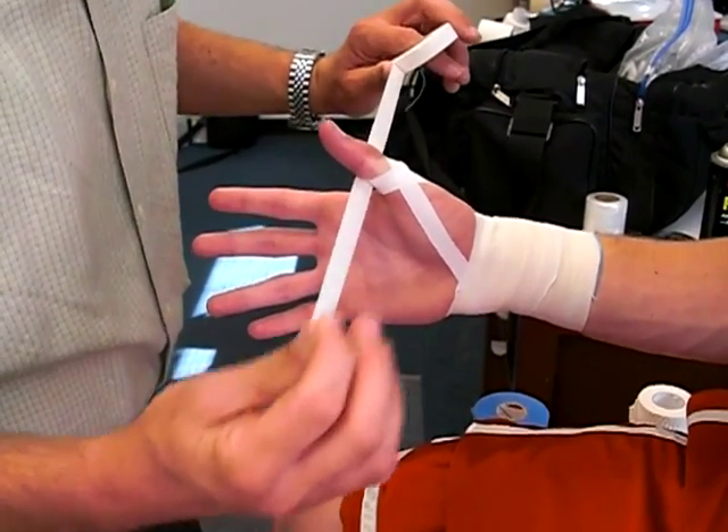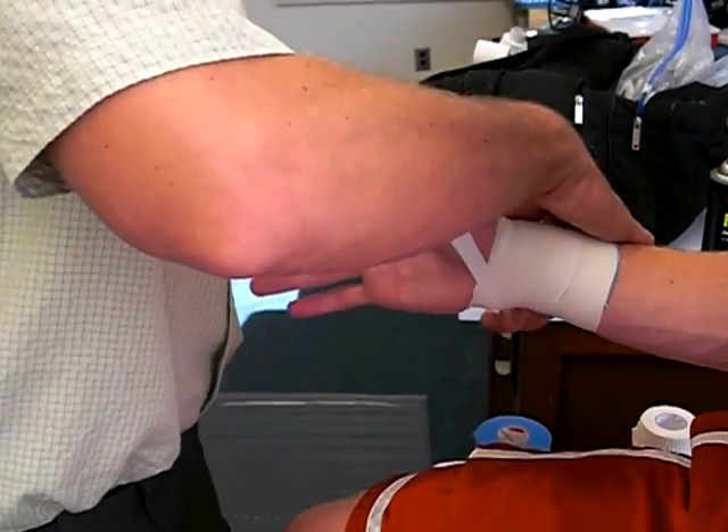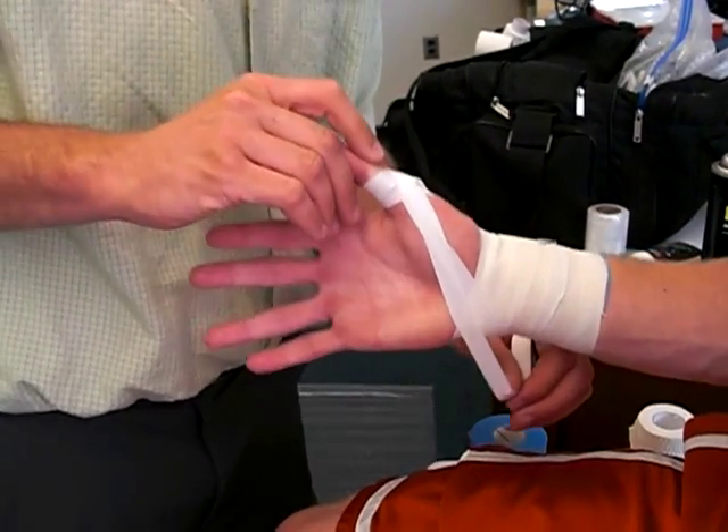You don't want to make it too tight, because you want that thumb to still get blood flow. You're pulling down in this position here, so you're restricting this movement — pulling down that way.